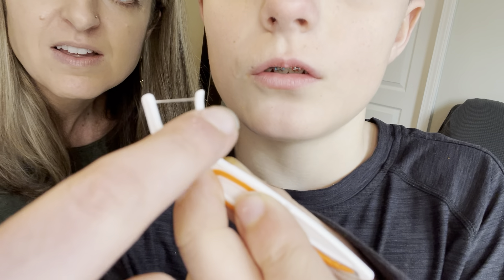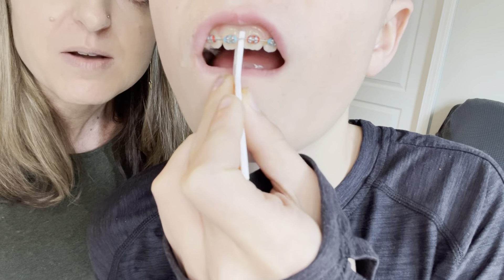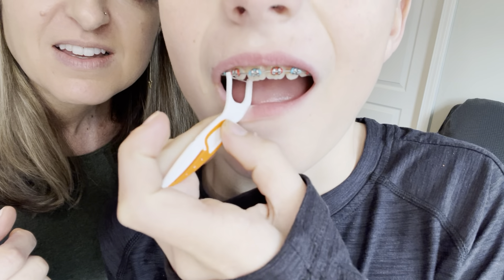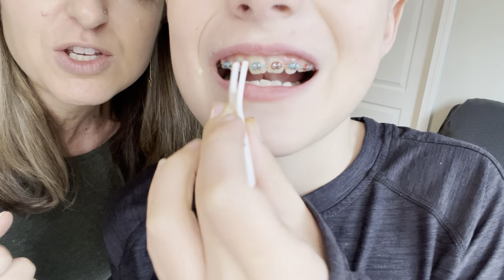This little part here just goes under the wire. That's the real skinny part. Because it's so skinny and it's curved, you're able to get it up under your wire. That way you can continue to floss your teeth effectively even when you have braces.